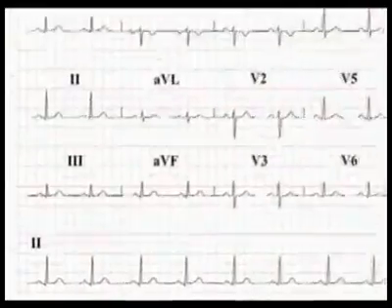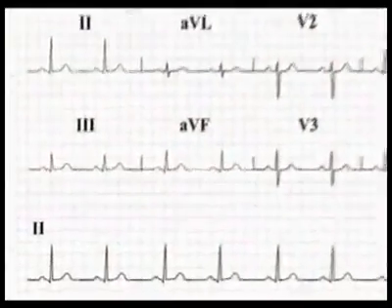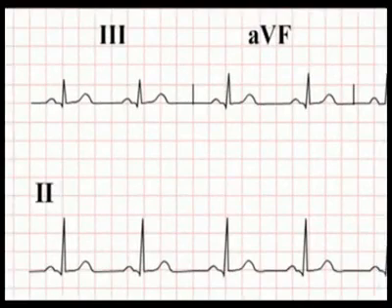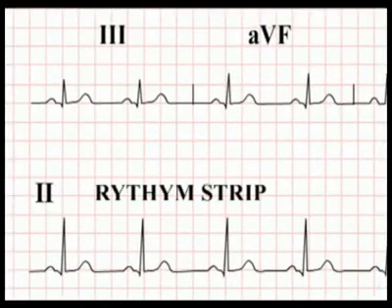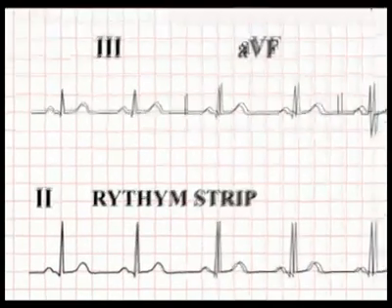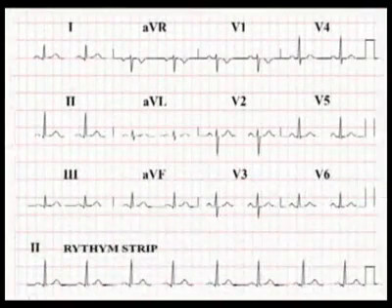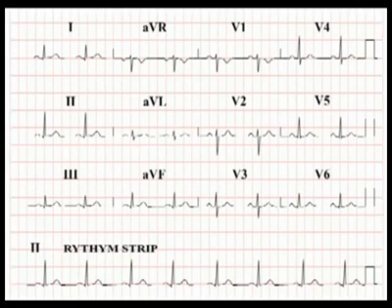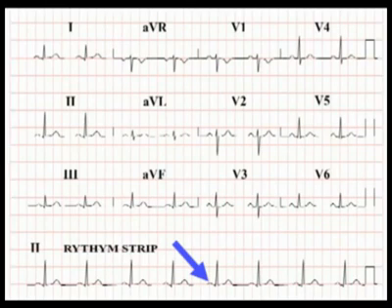If you look at the bottom of the ECG readout you will see a long run of recording from lead 2. This is called a rhythm strip. We use the rhythm strip to calculate the heart rate and to diagnose abnormal cardiac rhythms. Lead 2 is used as the rhythm strip as it is the easiest lead in which to see P waves, and identifying P waves is the key to interpreting rhythm disturbances on an ECG.